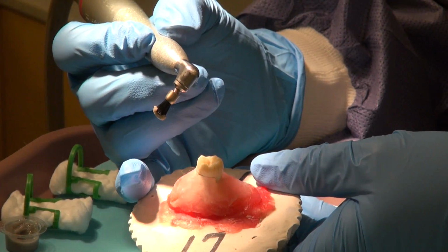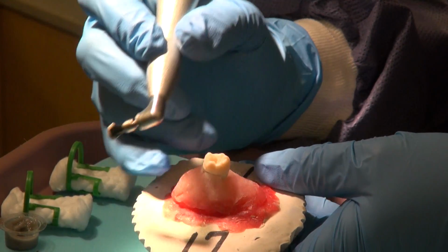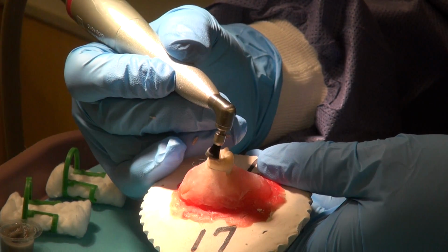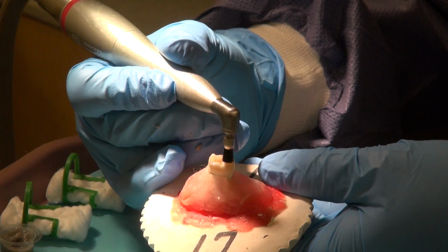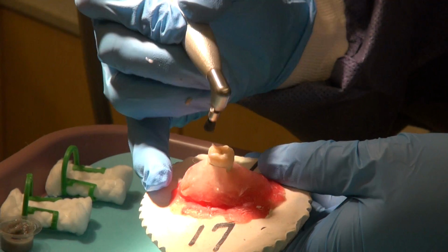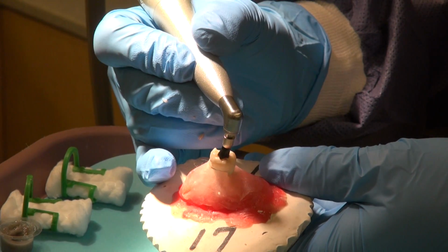Remembering to hold our instrument in a pen grasp using a fulcrum, we're going to place our bristles right into those grooves, with a little bit of pressure just to flex out those bristles, and overlapping strokes to clean off the tooth surface on just the occlusal.